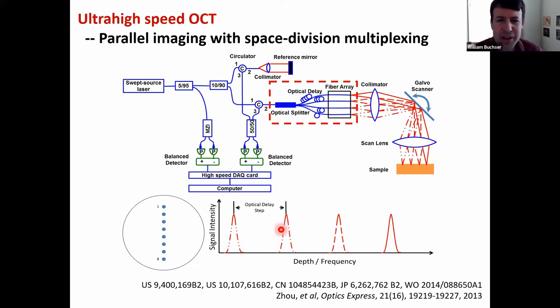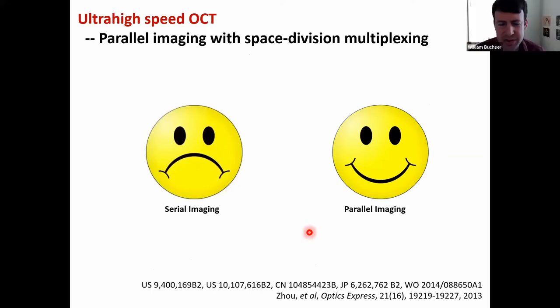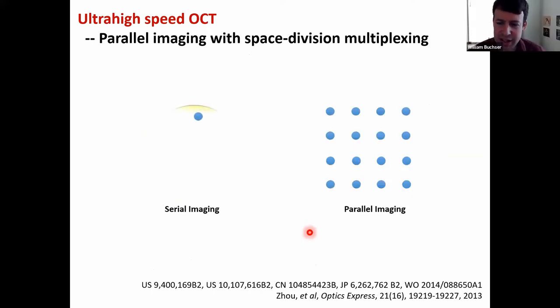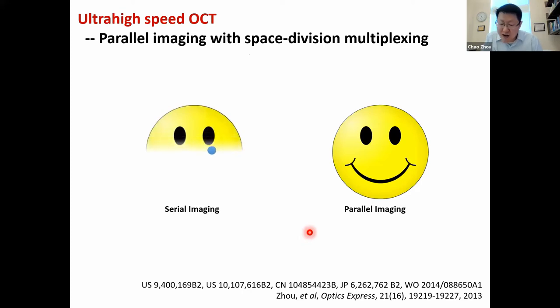Okay, that's really cool. Can you go back one slide? Yeah, this one. So the serial is like time domain OCT, and yours looks really cool, but where does spectral domain OCT fit in? Actually, both serial and the parallel are Fourier domain, and these are using a swept source OCT technology. Yeah, so spectral domain, you can also just use a single beam to scan the eye, and with swept source, it's already faster than spectral domain system, but on top of the swept source, we added this space division approach.